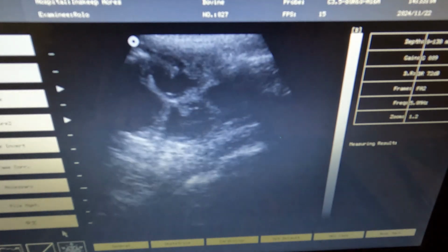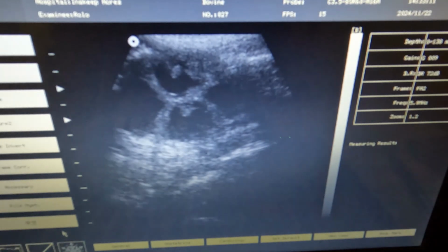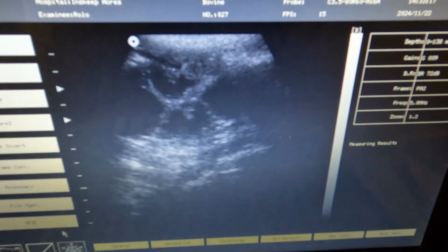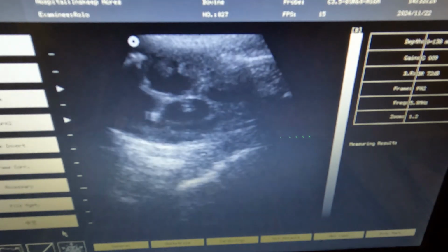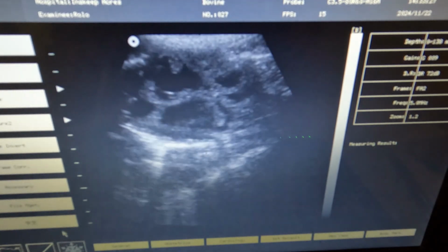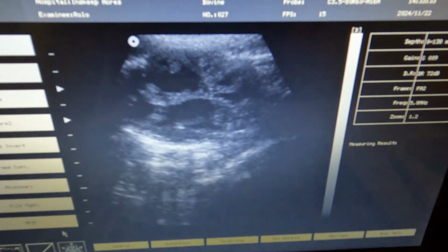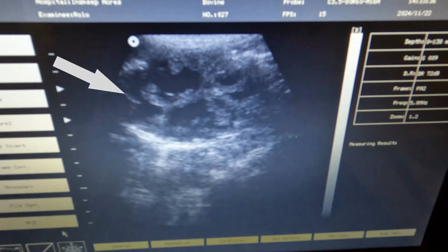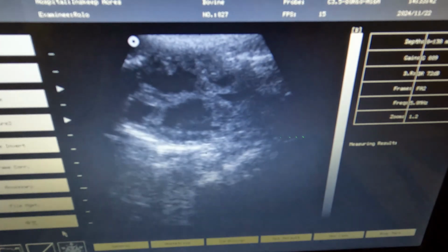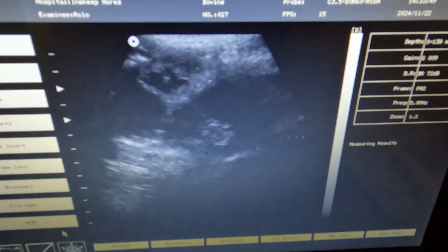And I believe I just saw one over in the right. Let's sit here just a second and see if we see some movement, and decide if there's actually 4 sacs or just the 2, and we're seeing ends, but it looks like there might be a cord there to the left. I think there's a good chance she's got 3 to 4 in there.